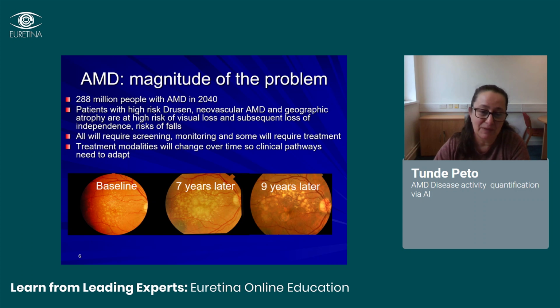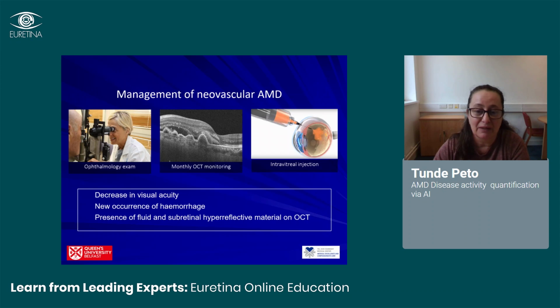And you will see that between baseline and 9 years later on this picture, one of my patients, the drusen get more and more numerous. At baseline and at 7 years, the patient has 6/6 vision, and only 9 years later, the vision starts being lost due to geographic atrophy. So the issue is that this patient will have been seen several times in this 7-year period, and how could we have done better?